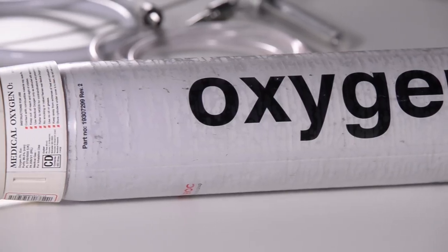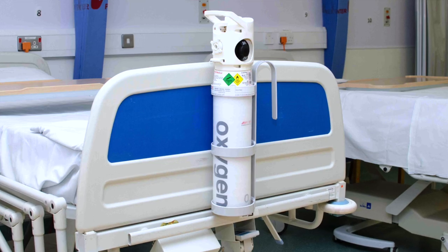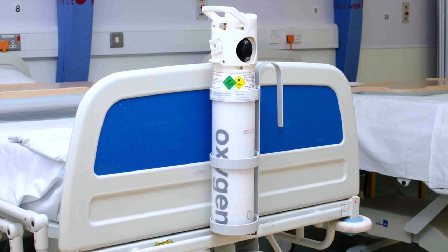Prepare the cylinder for use before placing near the patient. Do not place the cylinder on the bed with the patient. A suitable holder should be used where possible.